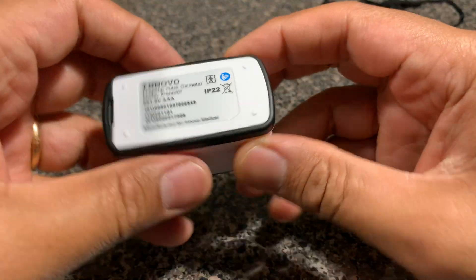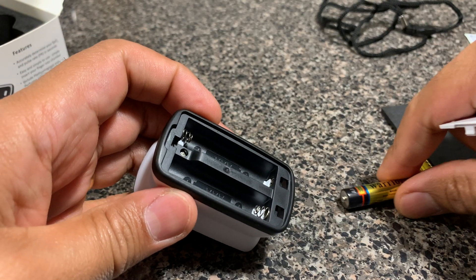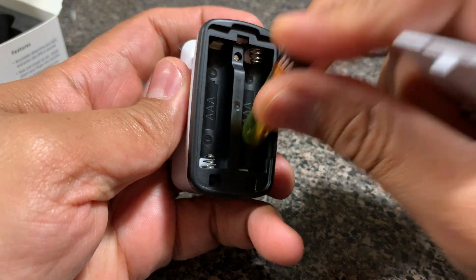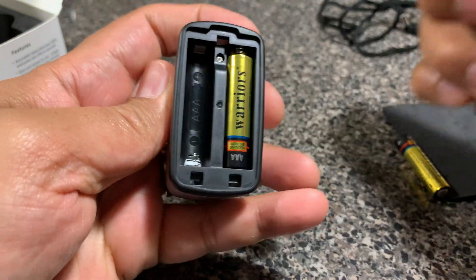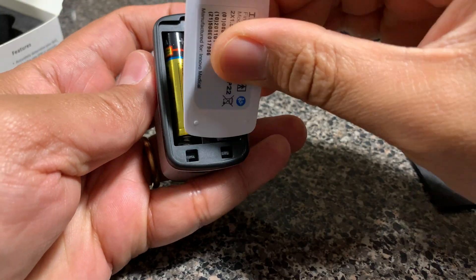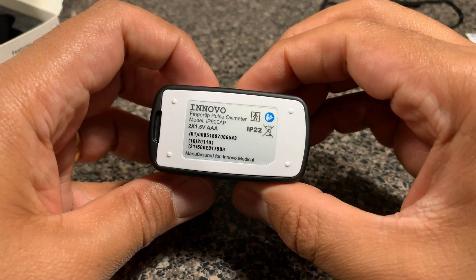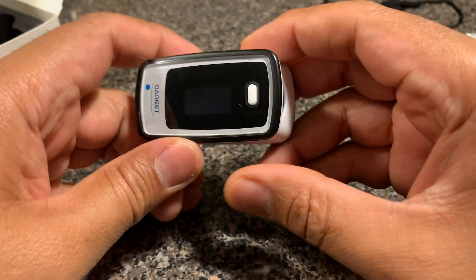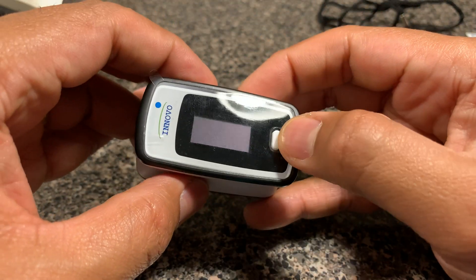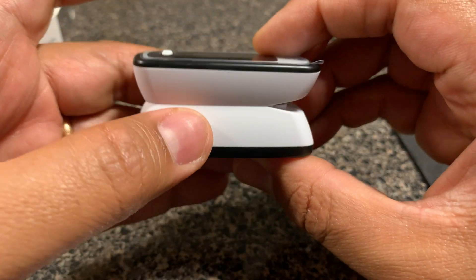So now let me pop the batteries inside and show you the interface of this unit and how it really works. Nothing special about sliding in the batteries — very typical. You'll notice that the unit does not have a complicated user interface; it's very simple. There's literally one button, a screen, and a slot for you to slide your finger in.